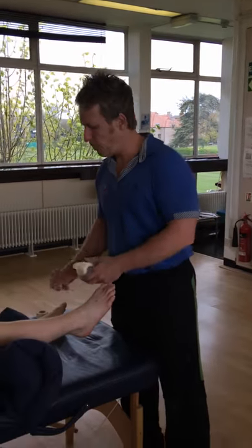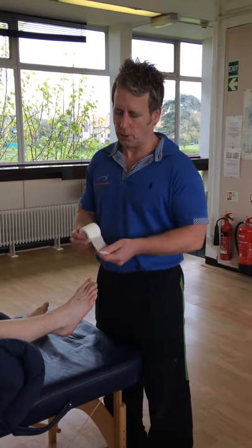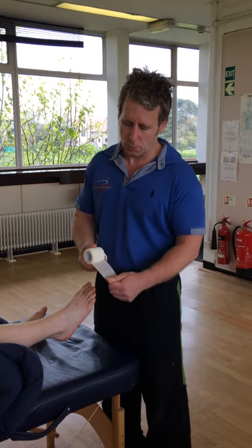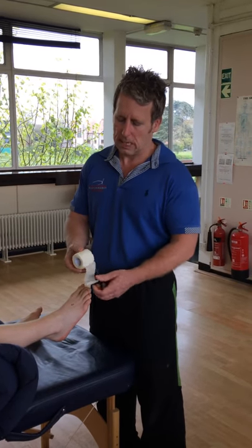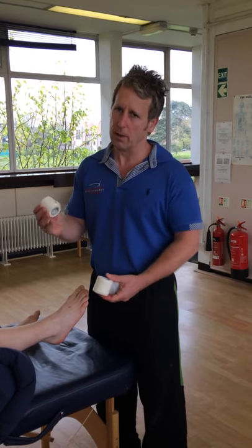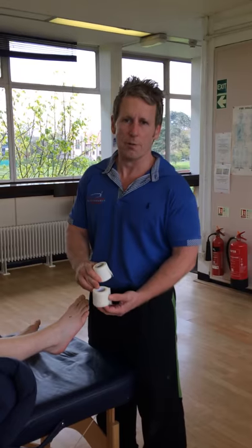Hi, my name is John Gibbons and today we're going to tape for an ankle inversion sprain using a relatively new form of taping known as the PowerFlex Power Tape System. We have an underwrap-type tape known as the PowerFlex, which will be the base layer, and then the power tape will directly stabilize itself and stick directly to the PowerFlex.